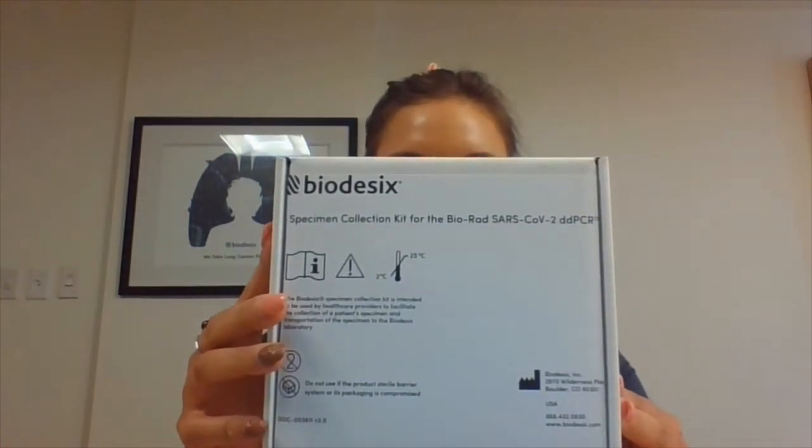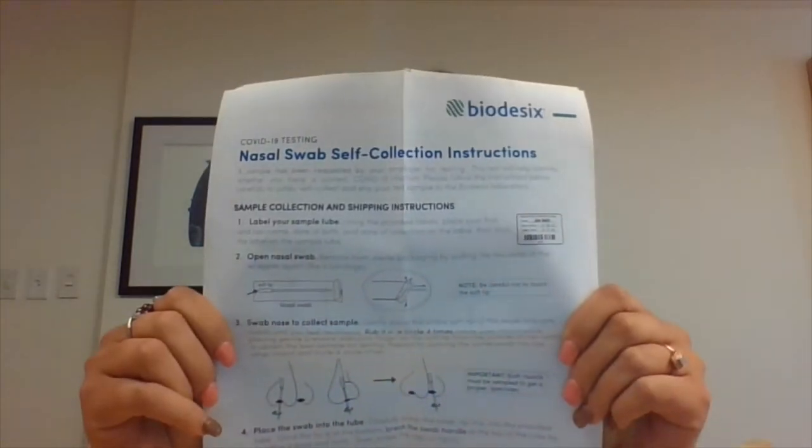Hello! Your employer has chosen to offer you COVID testing provided by Biodesics. I am going to walk you through how to collect your nasal swab and return it for processing. In the kit you received, you will find instructions for use. Use these to follow along with this video.